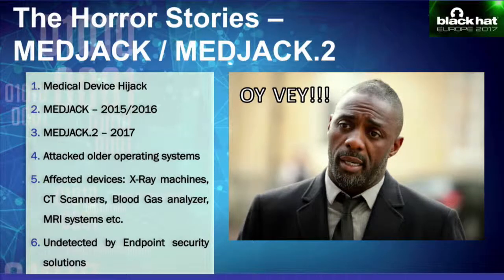So while there are many horror stories associated with connected medical devices, from ransomware to malware, I specifically wanted to talk about MedJack because of all the attention it got and all the damage it caused. MedJack, or medical device hijack, is a malware that first came out in 2015. It lived through most of 2016. And then MedJack 2 was a more sophisticated, evolved version of MedJack.